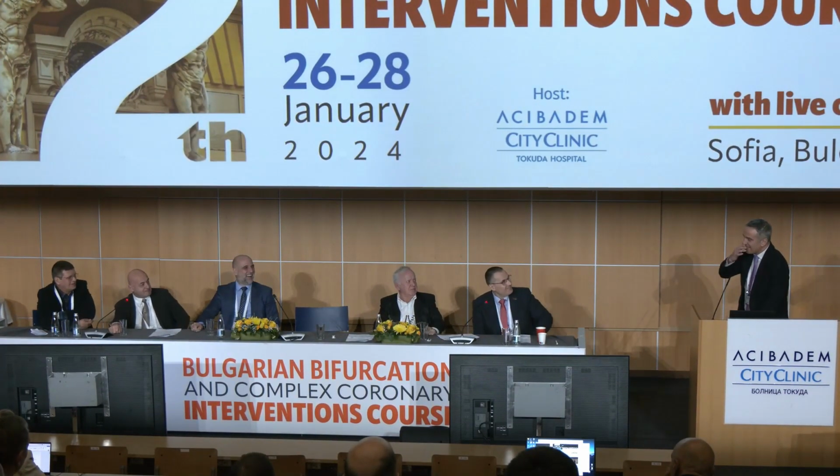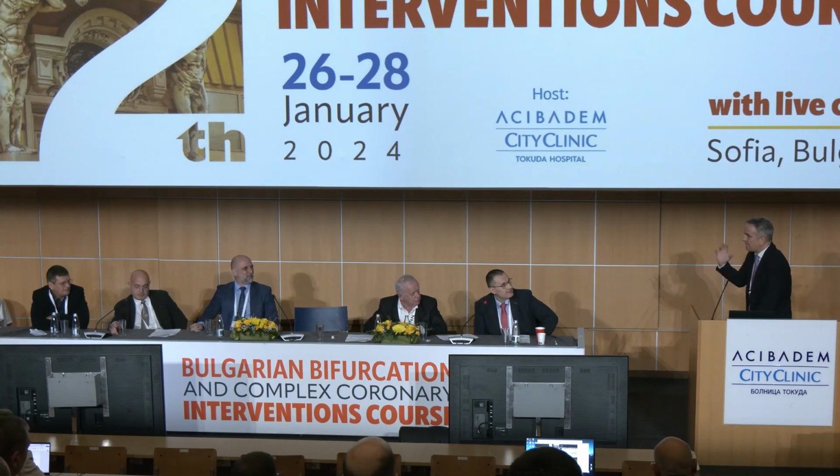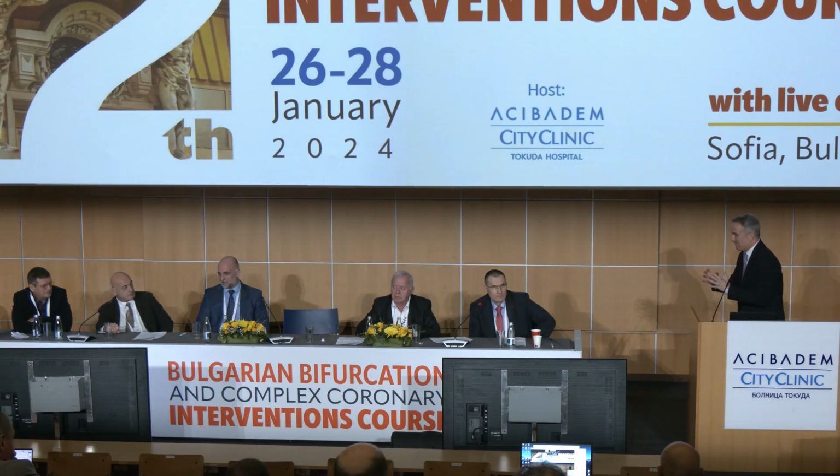But as I go around proctoring a lot, I've been to some places where they burn the patient. I said that radiation protection begins from the beginning, knowing that you can lower the dose, not have 25 frames per second, and have protocols with low radiation. Because if you are going near a nuclear bomb, no protection can protect you. But if there is just a small fire, then you can get protected really well.